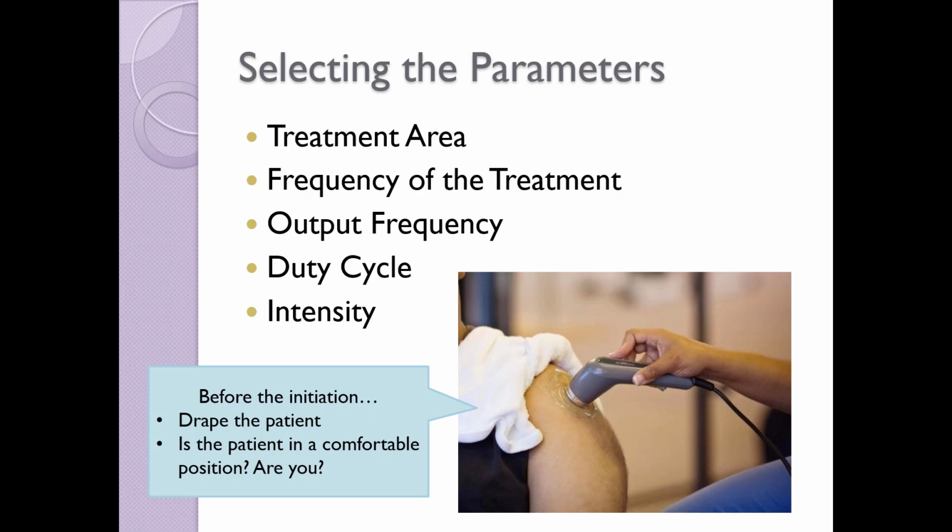Before we can start treatment, we need to make sure that we are draping the patient with towels. Since we use gel as a medium with ultrasound, the treatment can be a little bit messy. Also, we use towels because we need to protect our patients' and clients' dignity and appropriately drape them during treatment. We want to make sure that we're not exposing any area more than we absolutely have to perform our treatment.